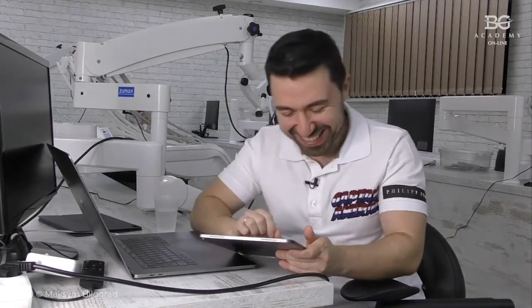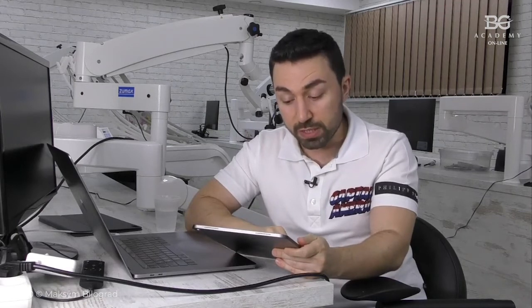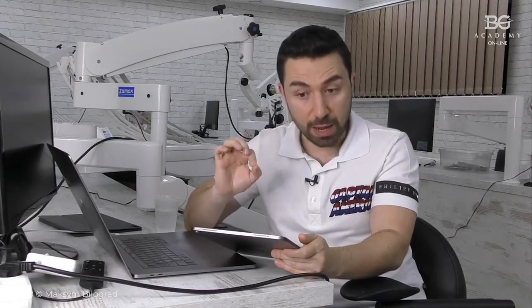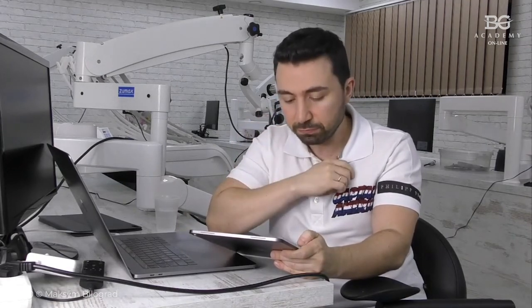Sorry. So another question from Ahmed. Last question, can I reduce ceramic proximally with burrs rather than rubbers? You can use burrs at the first step, but this is super important, you have to use special rubbers to polish your ceramic afterwards. This is a must.